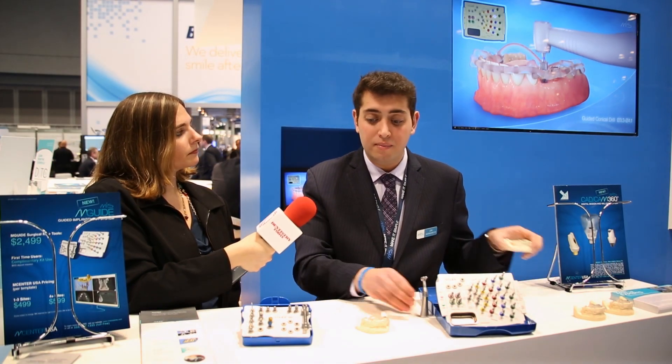Another division of our M-Center is a CAD-CAM division. We can actually pre-mill temporary units prior to surgery, so clinicians who do immediate loading can send their patients home with teeth. In addition to provisional units, we can also make custom zirconia abutments, among other great products.